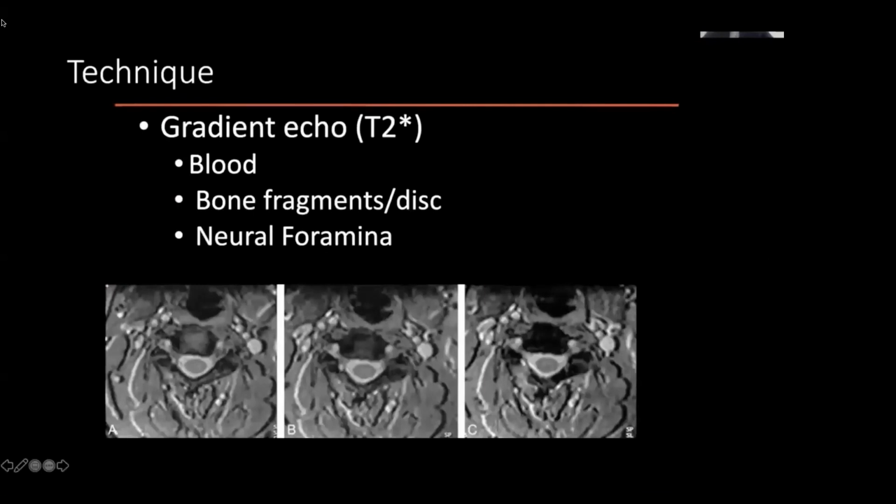Gradient echo, and we have multiple variants on a lot of these themes. So again, I'm really showing you the basic sequences here. You'll see a number of variations. So for example, you might see a sequence that isn't labeled as T2, but maybe it's labeled as FLAIR, or it's labeled as STIR in the case of the spine.